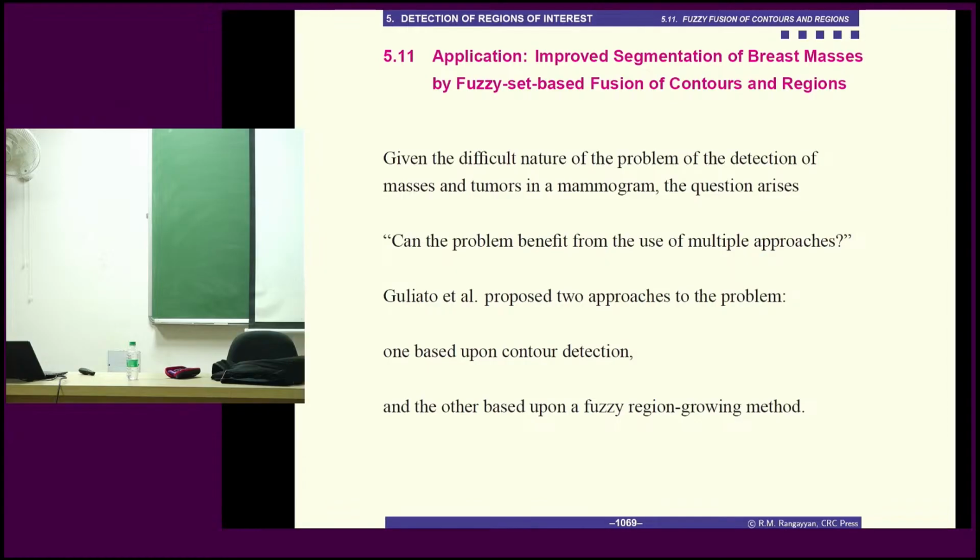But if you apply the full range of Gabor filters to the full mammogram, and we have done that, then we can detect all fibroglandular tissue. And we can use that for the detection of asymmetry and architectural distortion. So that comes up again later in chapter 8.